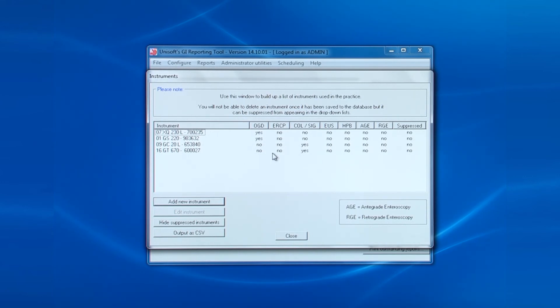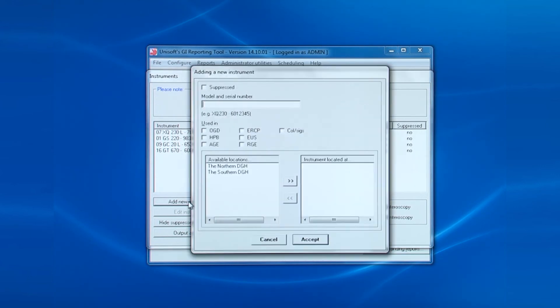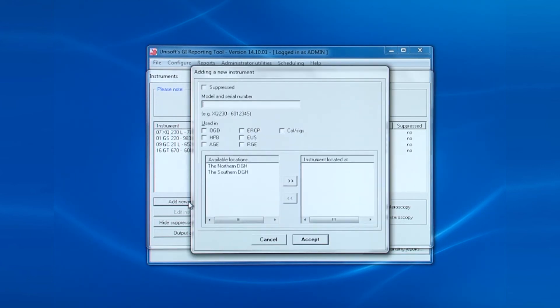Here's an interesting point. Because the scopes are always displayed in strict alphabetical order in the procedure screens, it is best to begin the instrument with the number the instrument is commonly known by. Then follow that with the model number and finally with the serial number.